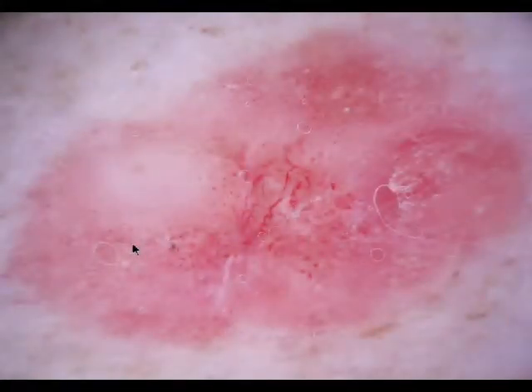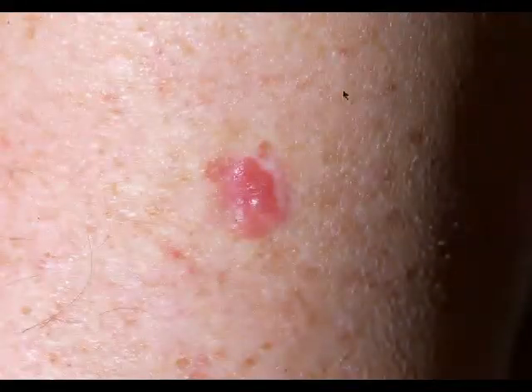This is a melanoma. Another example, clinically, dermatoscopically, which type of vessels do you see? Is it monomorphous or polymorphous? It's easy, it's polymorphous. You see one vessel type here that is different from the other vessels. These vessels are dots, and here these vessels are lines. What type of lines?